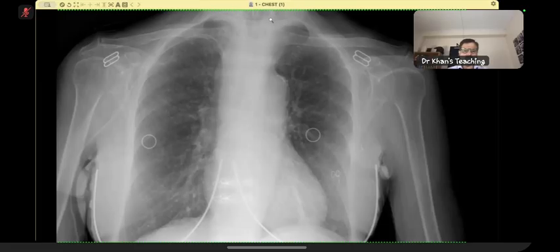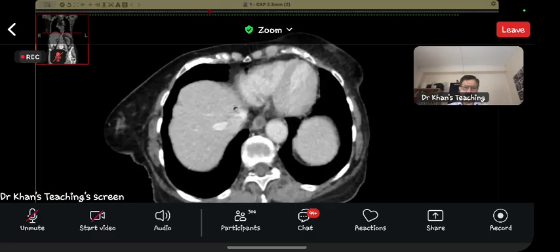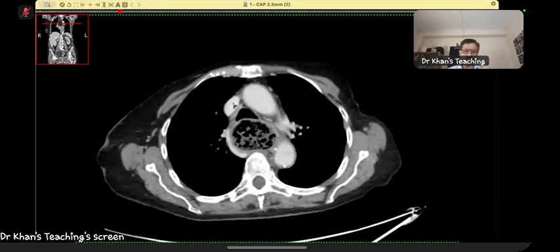And this was pseudoachalasia. Now, as far as the CT is concerned, a bit of fine touch regarding the local, which I'll tell you. Otherwise, again, it was well described.